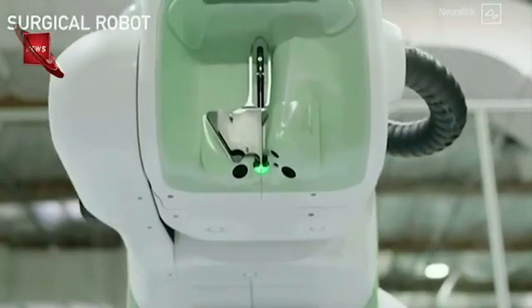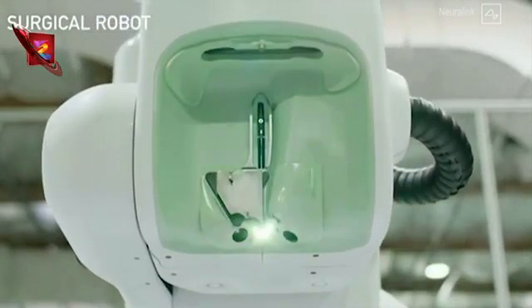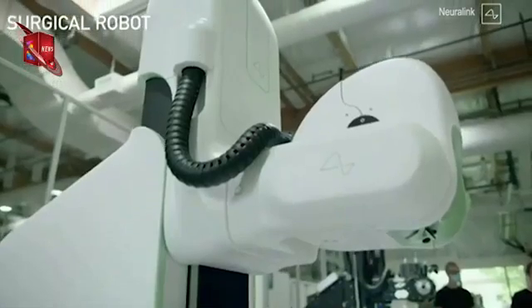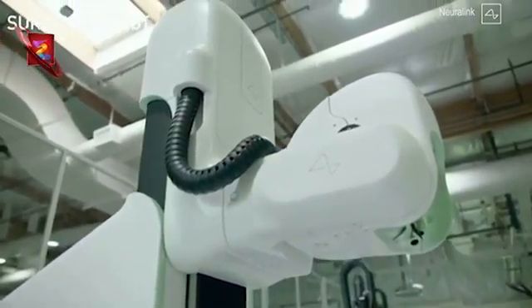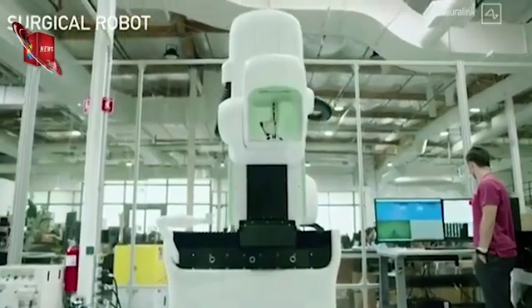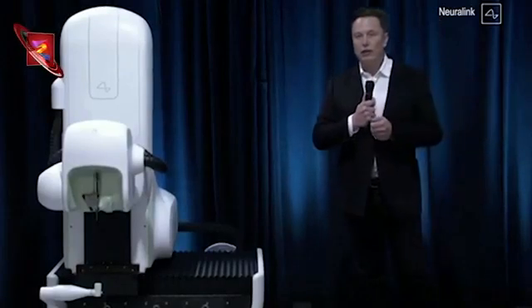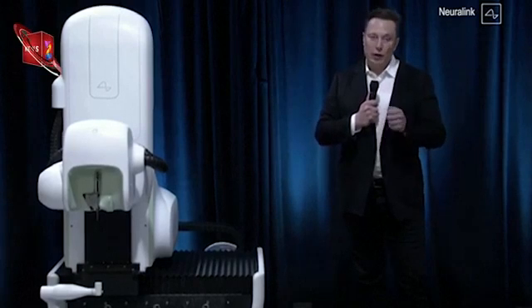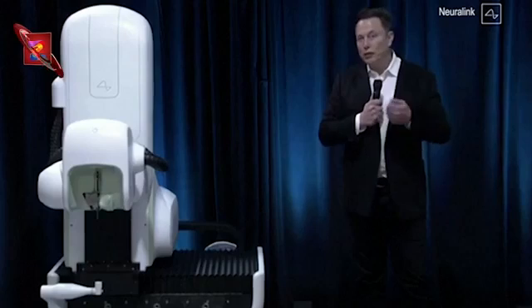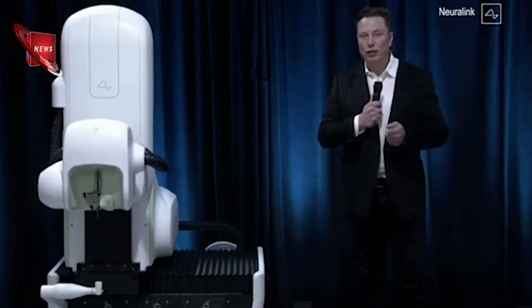And we ultimately want this robot to do essentially the entire surgery, everything from incision, removing the skull, inserting the electrodes. And we feel confident about getting the link procedure, the installation of a link, done in under an hour. So you can basically go in the morning and leave the hospital in the afternoon.